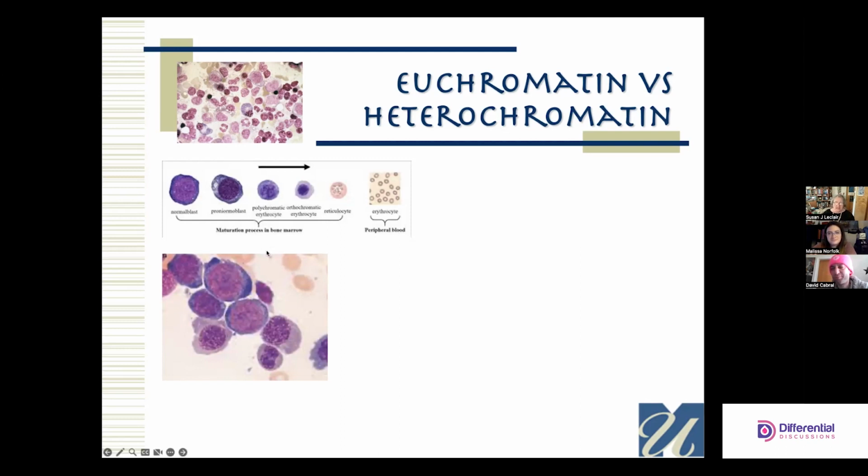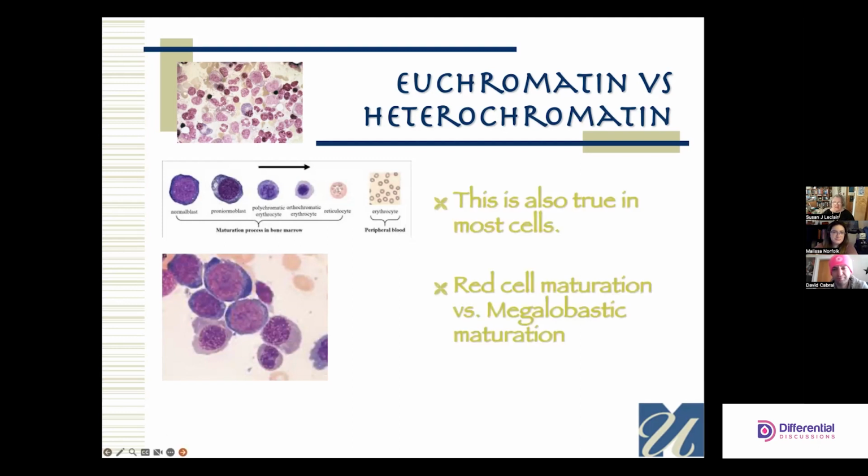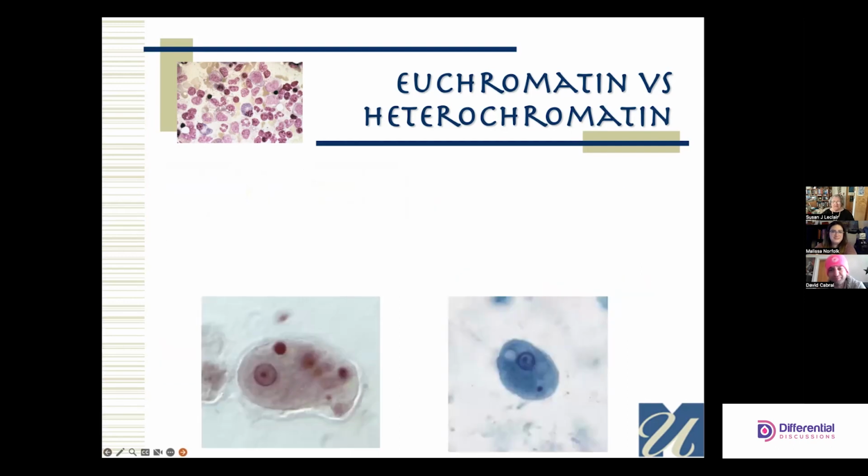So there is always a disjunction between the maturation of the red cell, you can see that, which is really hemoglobin here. Yeah, I'm getting hemoglobin. And a disjunction with the nuclear maturation, which is not so much. So you get an asynchrony. Nice word that we use often with this, an asynchrony in maturation. Here you go.